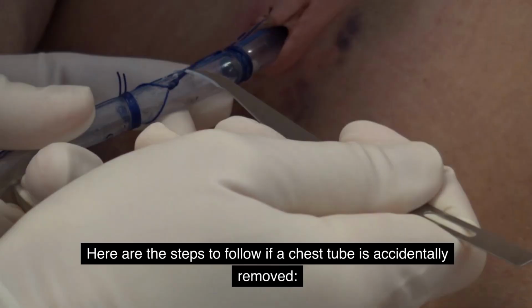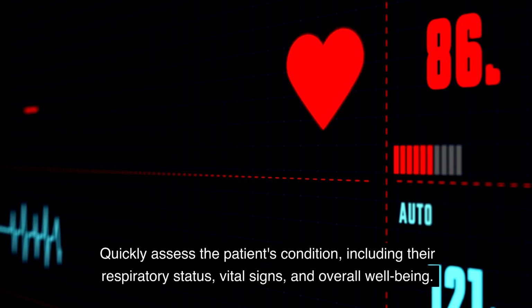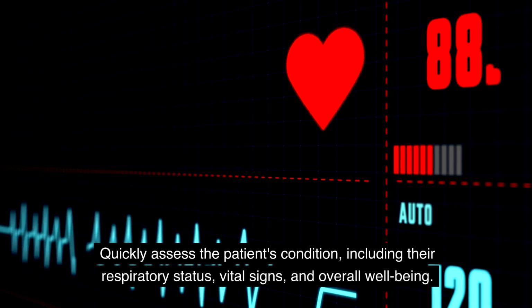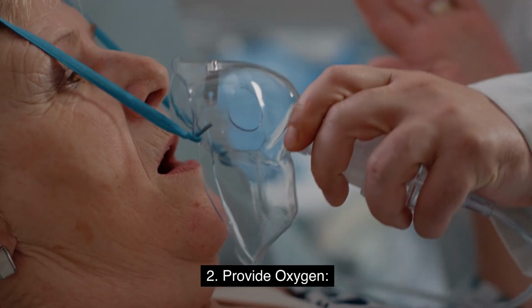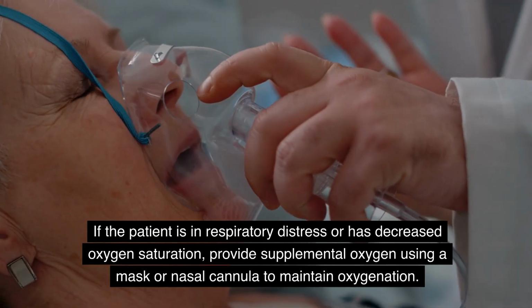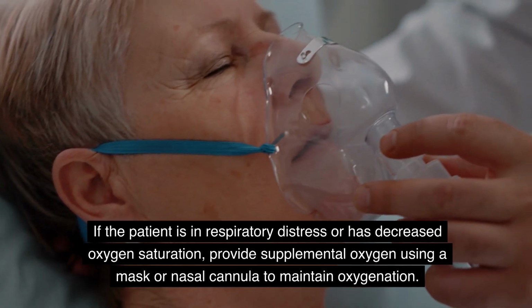Here are the steps to follow if a chest tube is accidentally removed. 1. Assess the situation. Quickly assess the patient's condition, including their respiratory status, vital signs, and overall well-being. Look for signs of respiratory distress, such as increased respiratory rate, chest retractions, and decreased oxygen saturation. 2. Provide oxygen. If the patient is in respiratory distress or has decreased oxygen saturation, provide supplemental oxygen using a mask or nasal cannula to maintain oxygenation.